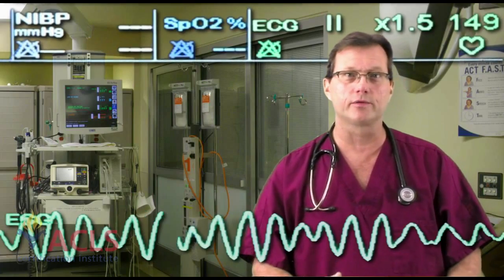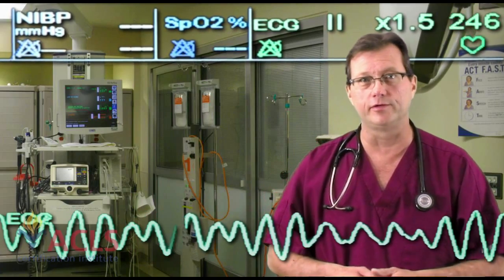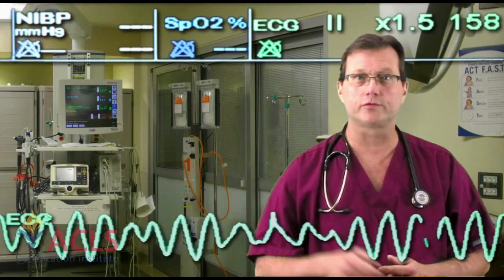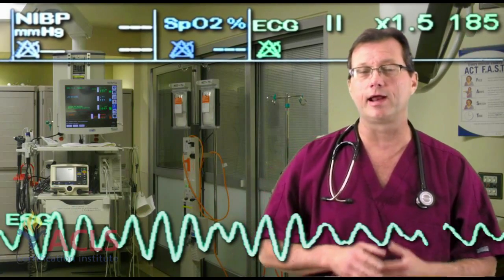So you see the patient coming in through the doors. Good, we get him in. We're going to get him whipped over to our monitor real quick. Take a quick look at him and we see this. VFib. Check a pulse. Again, we check for a pulse no more than 10 seconds. Patient does not have a pulse.